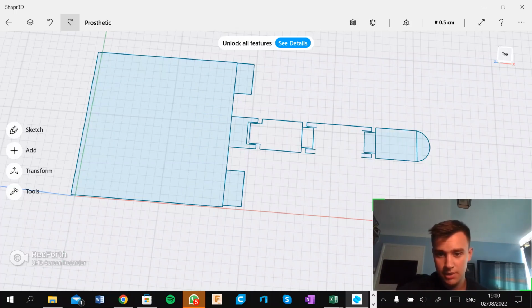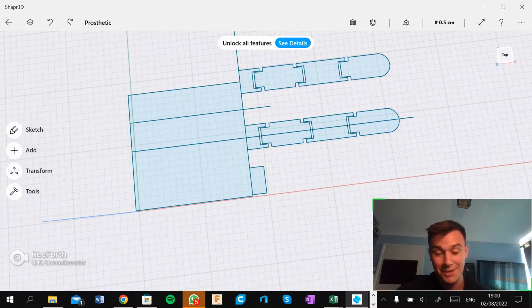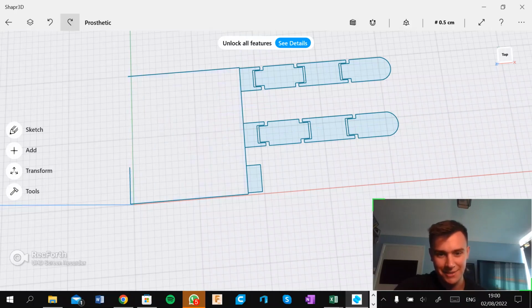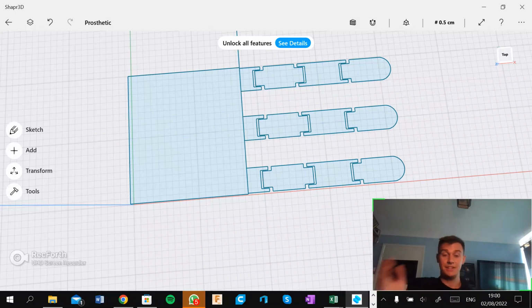And we'll see it soon. There we go. And then I think the good thing about Shaper is as soon as it becomes solid, it goes like this and it gets shaded in the middle, so you know if you've missed out a line, which is very helpful. There we go. So just going to skip through a little bit more here. There is some embarrassing mirroring where my math skills did not work to my advantage, but we get there. We do get there eventually. And there we go. And that's what's brought me up to my design at the moment.